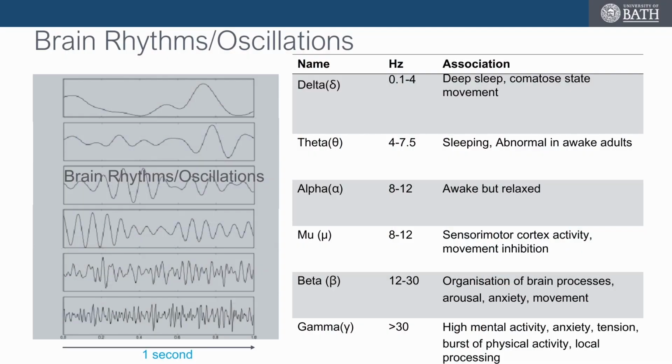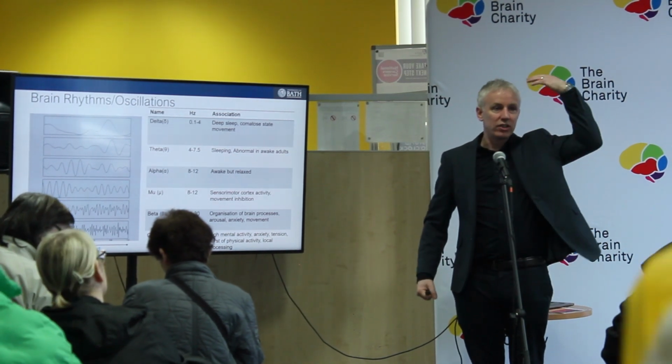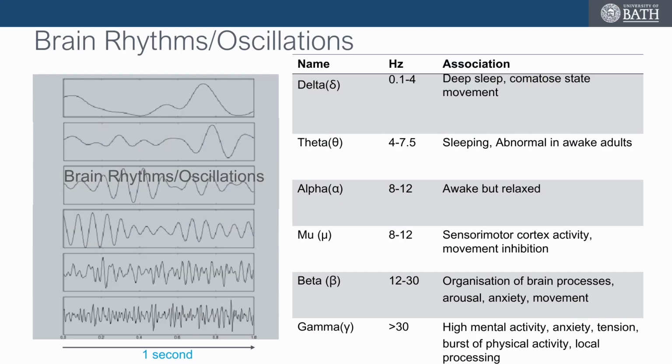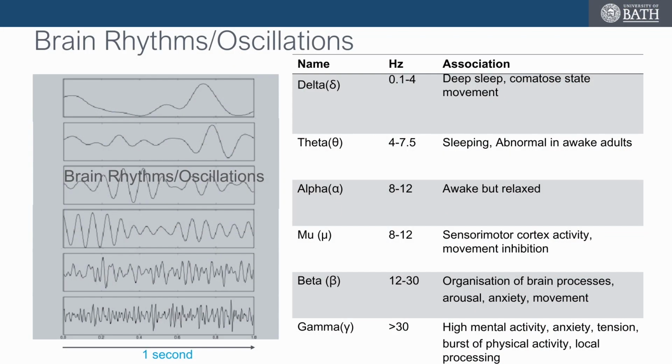If you think about this wave here, which is a beta rhythm, it's a fast component, and this one is a slower component. Whenever you're doing no movement, you'll see a lot of the slow activity in the motor area. That's the movement-related area of the brain. Whenever I perform a movement, such as lifting weight, I'll see that change on the opposite side of the movement, and vice versa. So I can start to detect which movement a person is performing just by looking at the squiggly signals. And if you do the movement, you can change the signals, but if you imagine the movement, you can also change the signals.